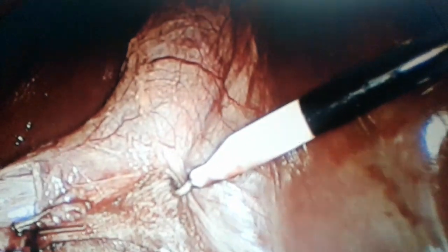So let's go ahead. Just for the purpose of knowing this instrument for undergraduates as well as postgraduates, just remember basically the two active parts, the tip of the electro hook and the shoulder of the electro hook. This white part is the insulated material in order to prevent inadvertent injury, so that we cannot accidentally touch the other associated, the nearby organs.